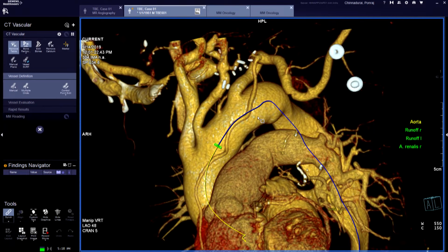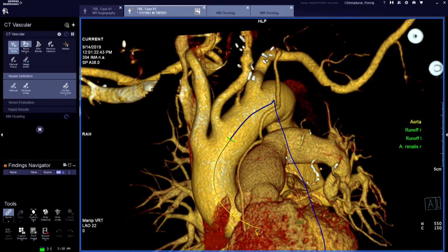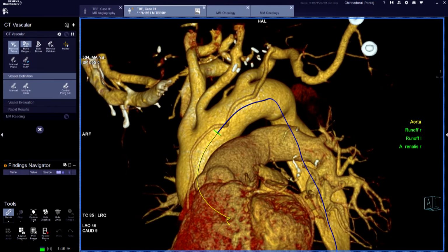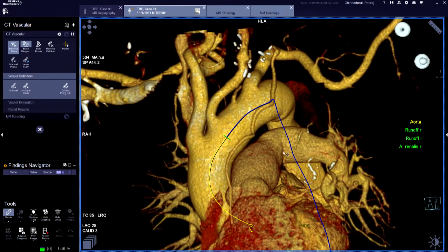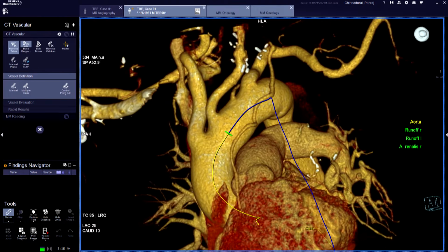In this particular case, I'm sure Dr. Lumsden and Dr. MacGillivray, you have done this plenty of times. What we ended up doing is reimplant and transposition the left vertebral into the left carotid and do a carotid subclavian bypass, so that way we gain all these landing zones. We want to make sure our device lands right where this green disc is that you are seeing here.